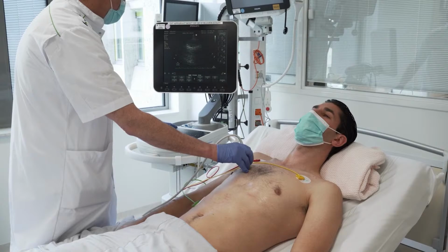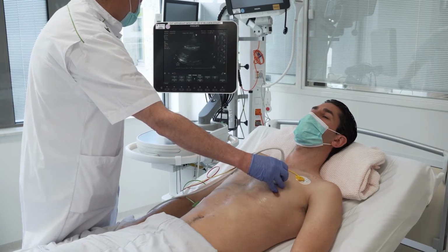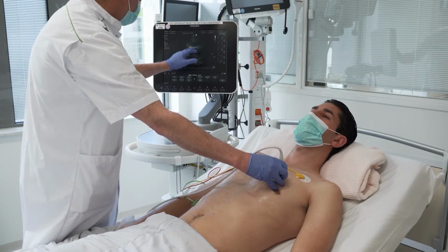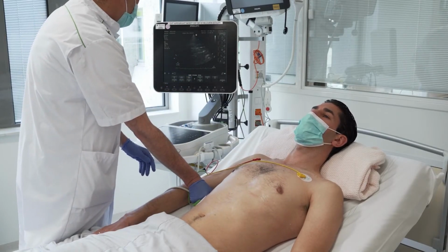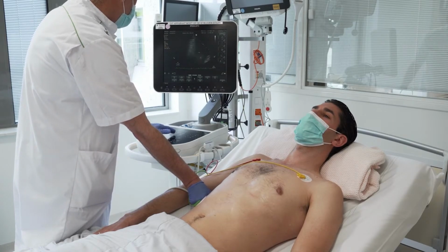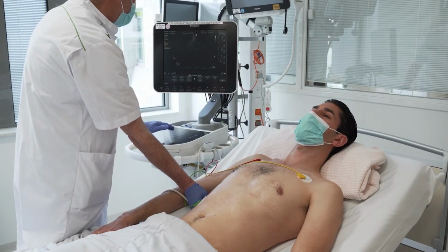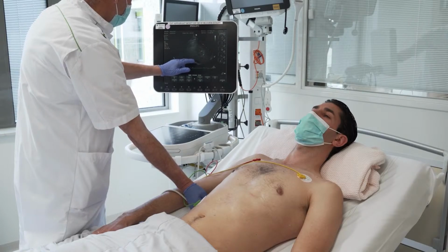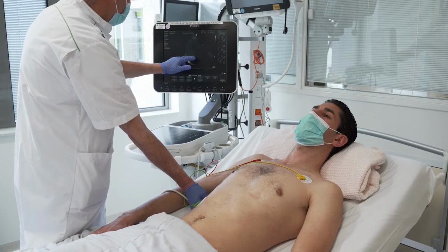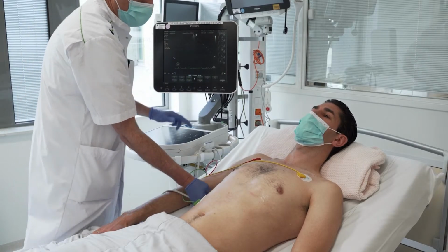Now I'm zooming in for the pneumothorax on the right, pneumothorax on the left, good lung sliding. So it's very fast. I'm going here, thank you. I'm playing with my depth again, looking for the diaphragm. You have to play with your probe to get the good configuration. I like to have the liver on the right side. So I see my diaphragm, I see no hematothorax, I see no subphrenic fluid, I see empty Morrison pouch, ready.